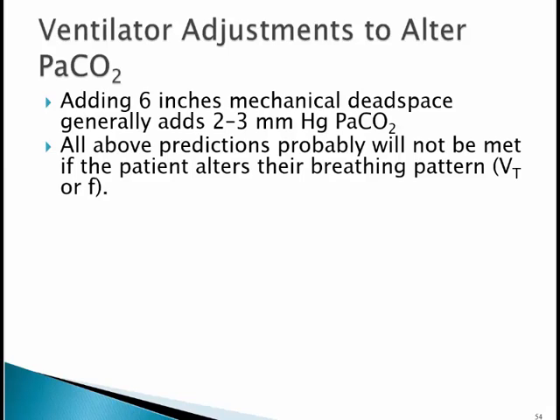Now, typically in practice or in this area, we don't deal with dead space a lot. All the dead space that's there is not intended to be therapeutic for ventilation. It's the HME, it's the suction catheter. What we're talking about in this setting at the NBRC is actual additional dead space. And it's there with the intention of altering ventilation, altering the CO2 level.